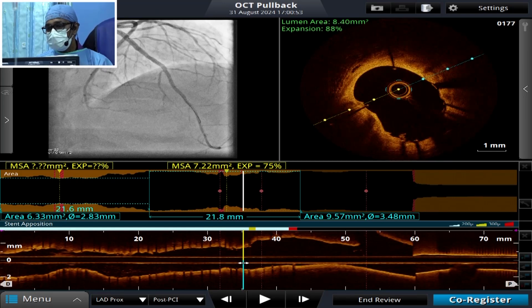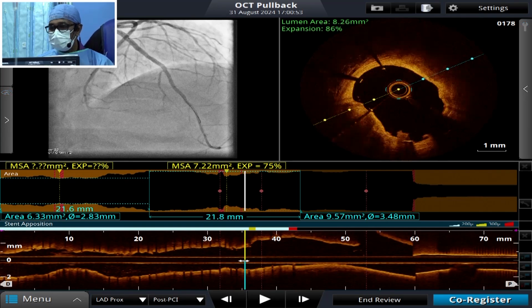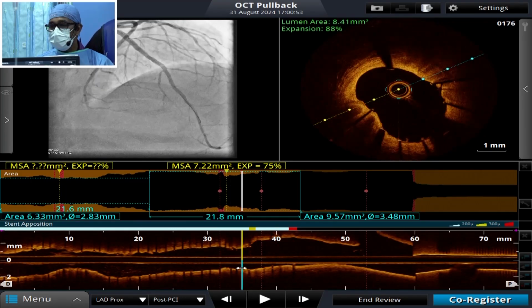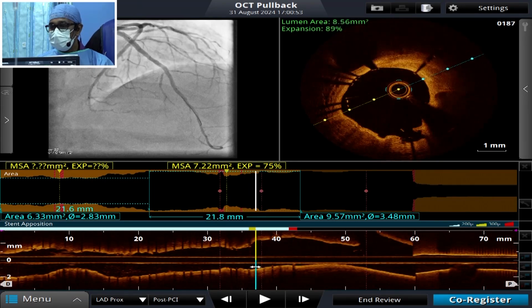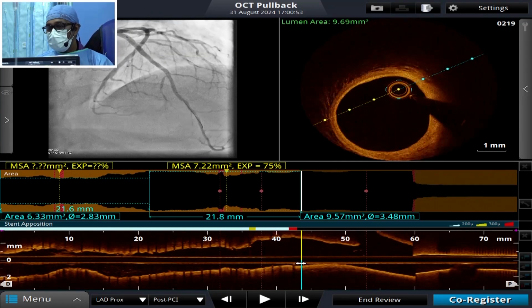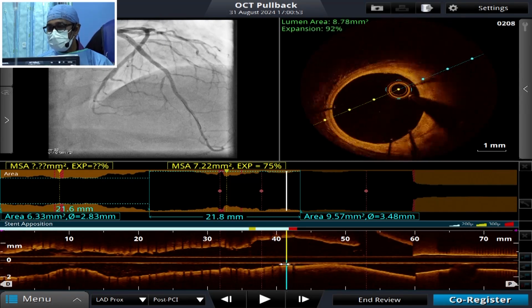We can see that the stent is reasonably well opposed. On the side of the nodular calcium, there is some malapposition, which is acceptable for us. Then that looks okay. So the proximal nodular lesion has opened up reasonably well, 8.59, 10 millimeter luminal area. That's very much acceptable. There in the proximal area, the stent is not well opposed, so that area alone we'll further oppose with a 4 millimeter balloon dilatation.